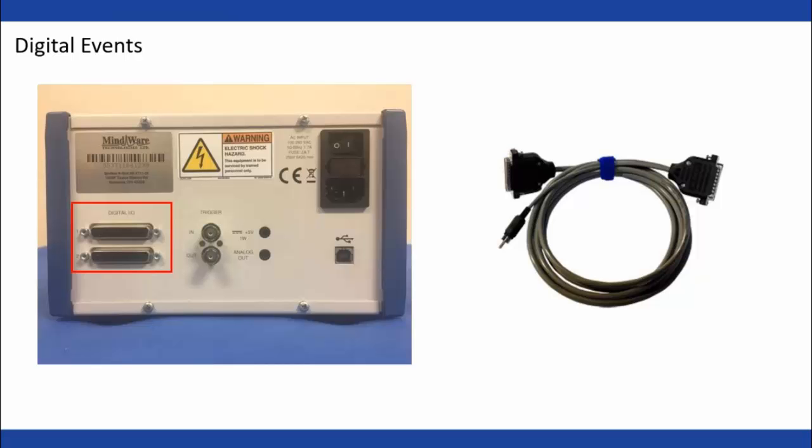And if you have a 2-slot or a wireless data center, this might look a little different, but there are still digital ports available on those units. They behave a little differently, and we're going to talk a little bit about the difference in those behaviors as well.